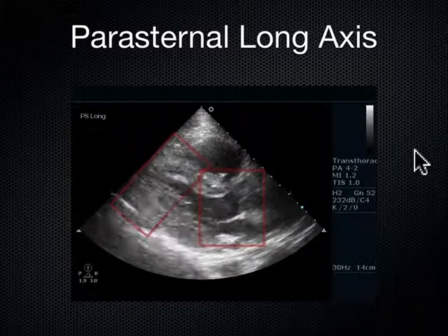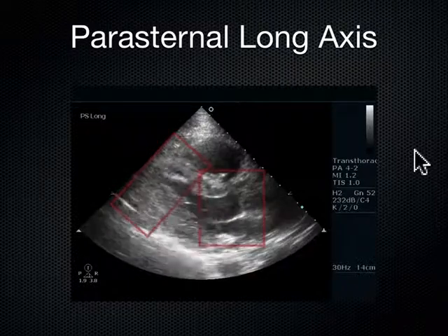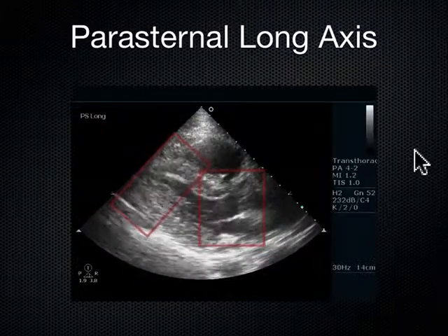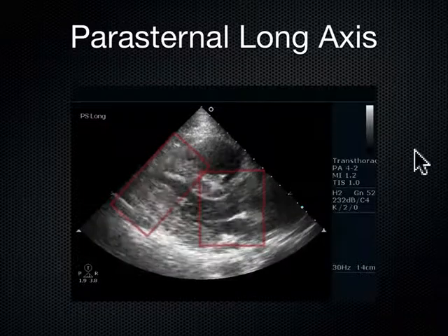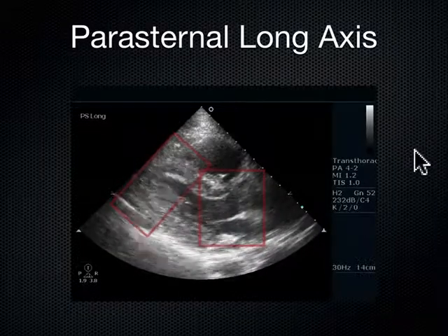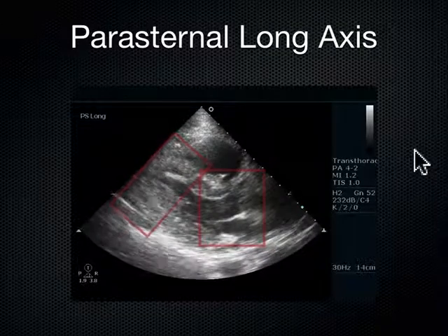Yeah, would the ratio change depending on the cross-section that you're taking, or potentially the angles? That's a good question. So how do we know that this is really, I mean, we've got this long axis through the heart. If I fan the sound from one side to the other through this cylinder-ish, cone-ish thing, maybe I'm just shortening my axis, my view of it, right?